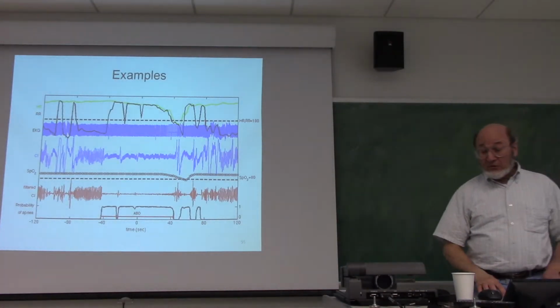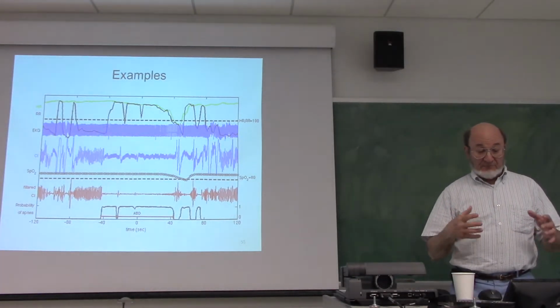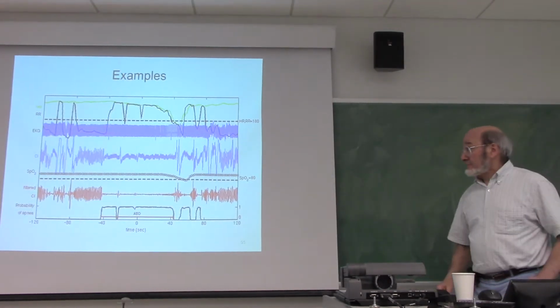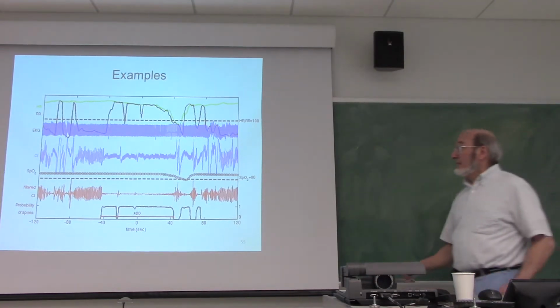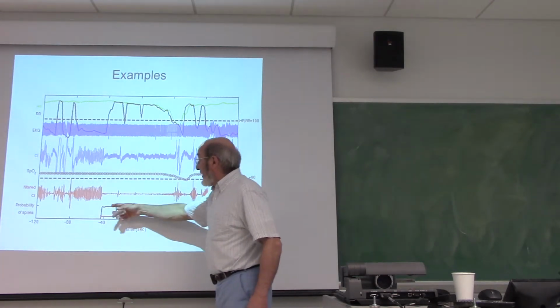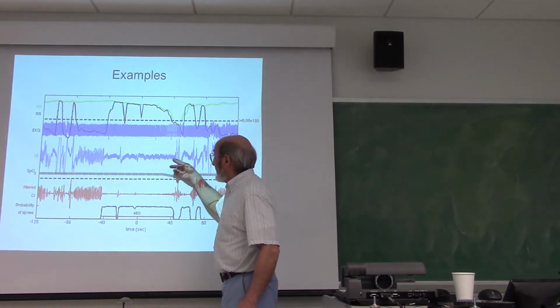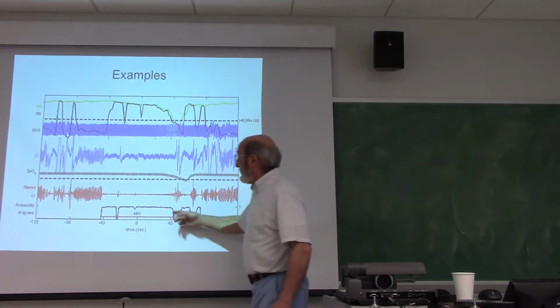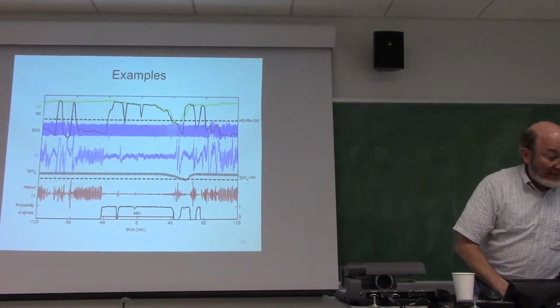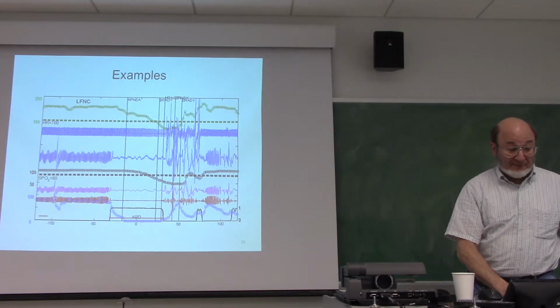That's very good in this field because I didn't really show you how much that chest impedance signal is filled with other artifacts, motional artifacts. And so we're doing much better than the systems had previously. Here's the same example. In fact, baby was breathing, stopped, big cardiac artifact confused the monitor, but we see that that was a long apnea. And by the way, that apnea lasted almost 90 seconds, and the monitor never saw it.